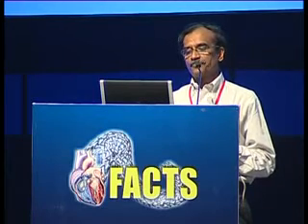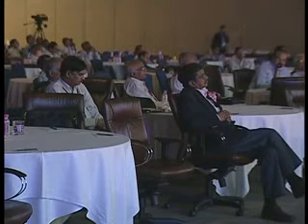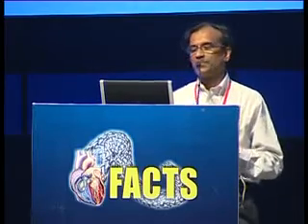So what can we do? This entrapment is usually due to a thick and tough septum, and one way of overcoming this is to advance the stylet, and once you advance the stylet, you make a clockwise rotation. This clockwise rotation makes the catheter perpendicular to the interatrial septal plane, and when it is perpendicular, it's much easier to advance. Once you advance the catheter, give a counterclockwise rotation to reach the anterior part of the left atrium and the mitral valve.